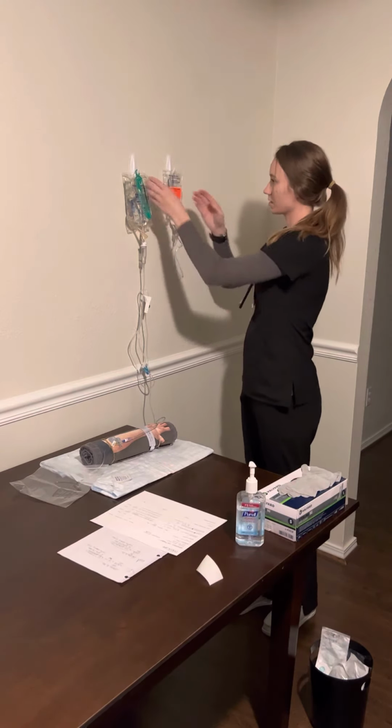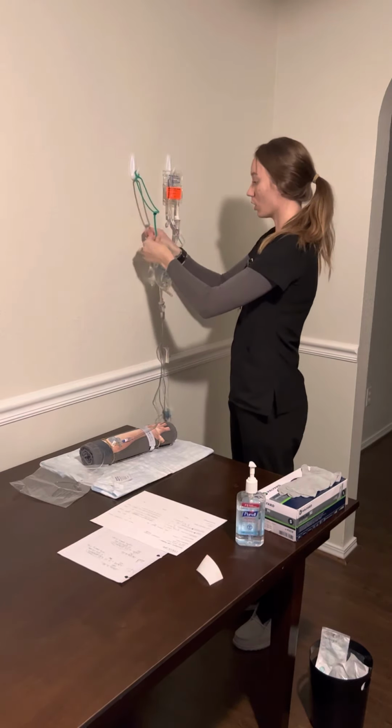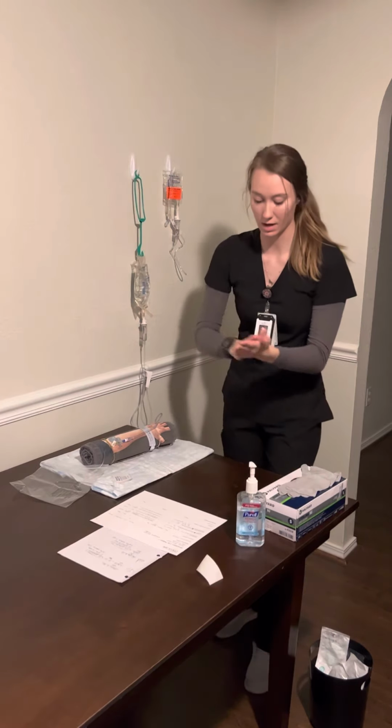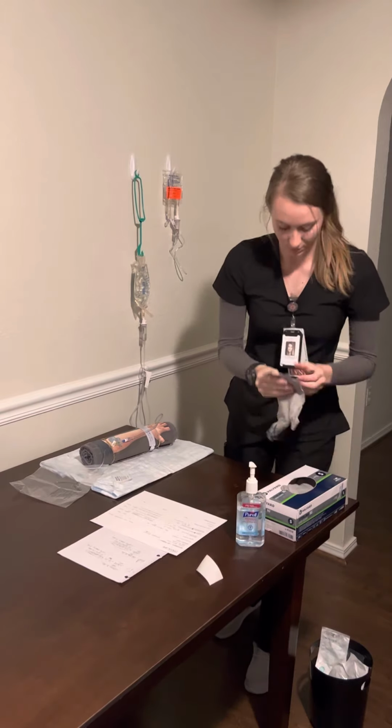And then before connecting that to the primary, we're going to make sure the primary is hanging lower than your secondary. I'm going to wash my hands and assess the site now that we have fluids running. So I'm going to grab a pair of clean gloves.